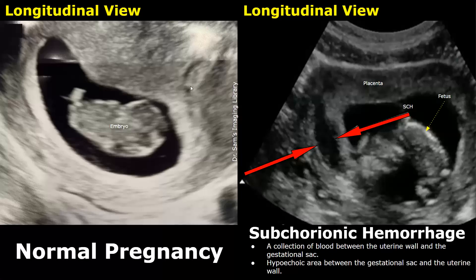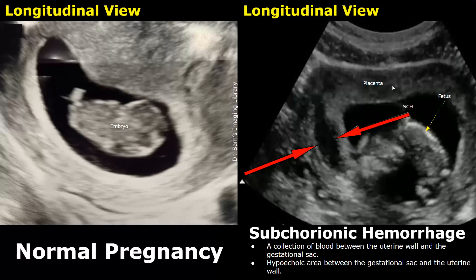And over here, we have a case of subchorionic hemorrhage. This pregnancy is more advanced than the image on the left. A subchorionic hemorrhage appears as a hypoechoic, dark area between the gestational sac and the uterine wall. The placenta is also present here. It is common for the hematoma to be seen near the margin of the placenta.